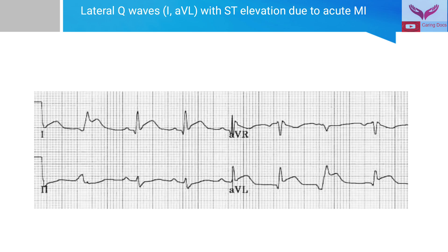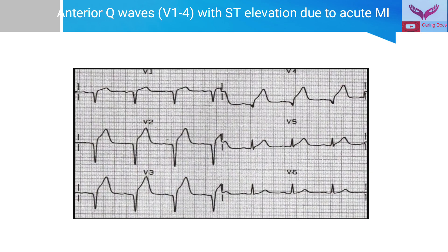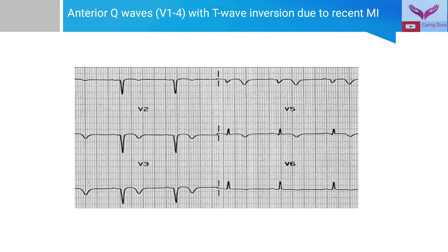This ECG shows lateral Q-waves, meaning Q-waves in lead 1 and AVL with ST elevation due to acute MI. Here again we can see Q-waves in V1 to V4 with ST elevation due to acute MI, and Q-waves in chest leads V1 to V4 with T-wave inversion due to recent MI.